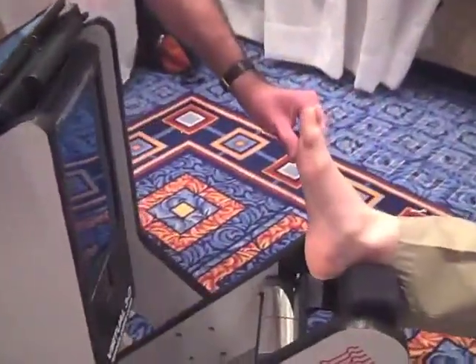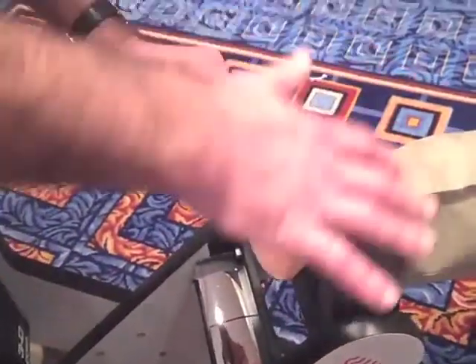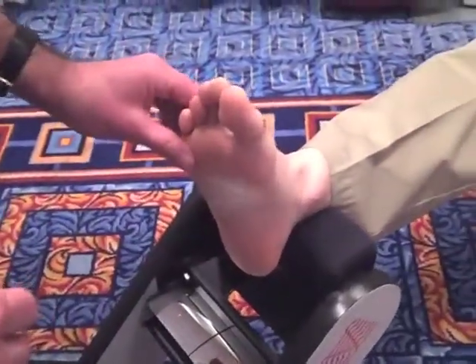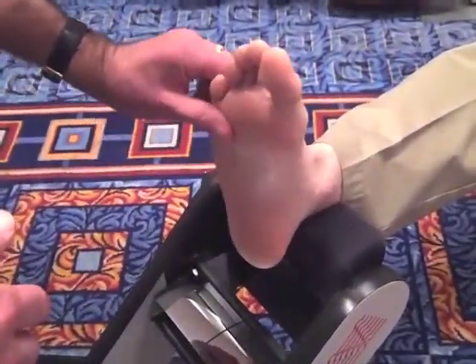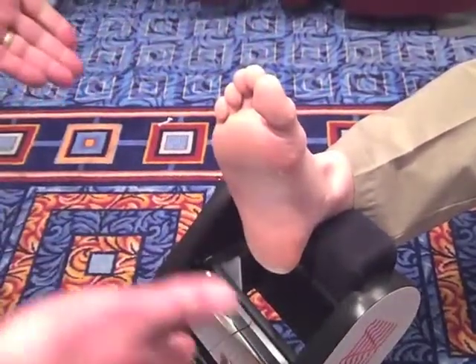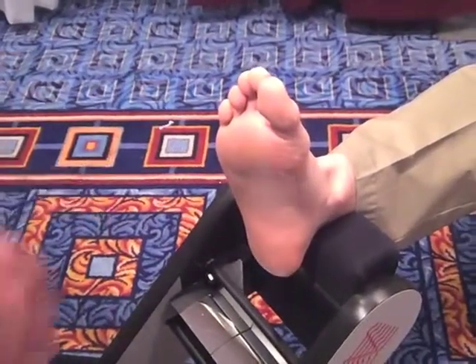We can capture the foot in neutral position, weight bearing, or off weight bearing. I prefer to capture neutral positioning and load the fourth and fifth — load the lateral column by putting direct pressure on the fourth and fifth metatarsal head. You can see I have enough room to move this patient's foot anywhere I want. I can position this foot with any of the techniques we normally use: load the fourth and fifth metatarsal head, do a suspension technique, or just do a standard unloaded digital map of the foot.